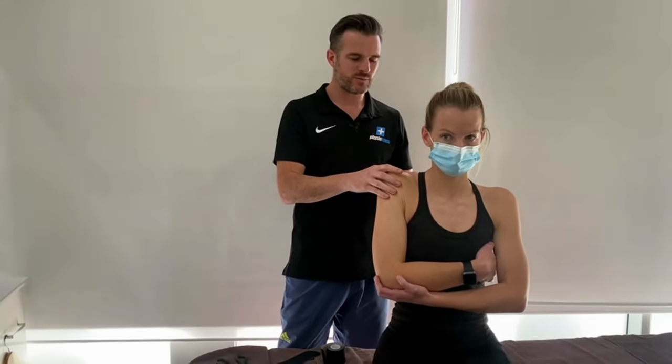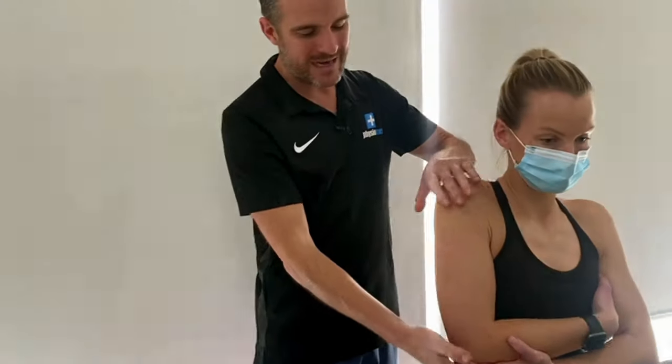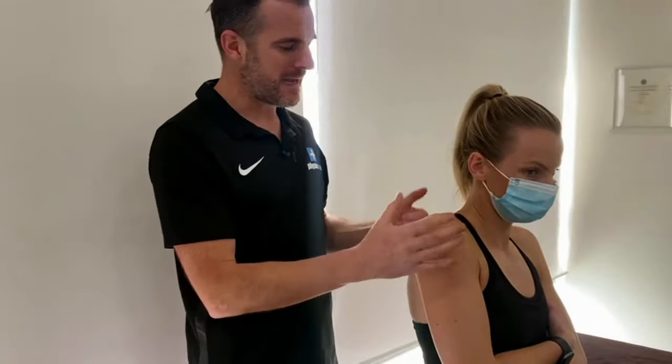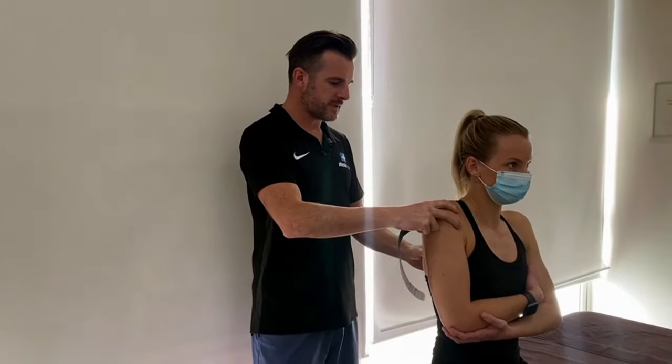I try to get them into a position of slight elevation and retraction because when I tape it up it's going to drop again, so I want them to be over-elevated and over-retracted to an extent. I ask, 'Is that relieving when you put all the weight into that arm?' That's where I'm going to tape them, so when they take that hand away the tape kicks in and should provide enough suspension to give them relief.